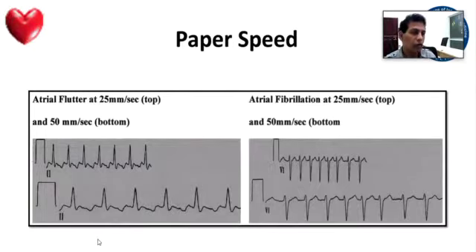We normally can identify this as a 2 to 1 block, not only by counting the small squares or anything, but just because we have seen this and we have trained our eyes to identify it.